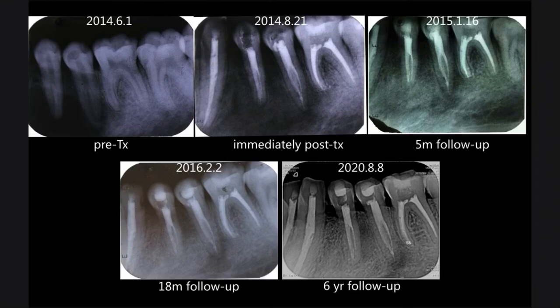And the second image, in the top row, shows the immediate post-treatment radiographs. And this is the 5-month follow-up and 18-month follow-up. And the last one is the 6-year follow-up. And this guy came to my clinic about 3 months ago. And from the X-ray, you can see the bone healing is very good.